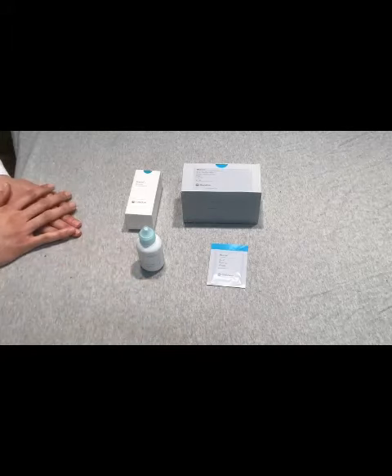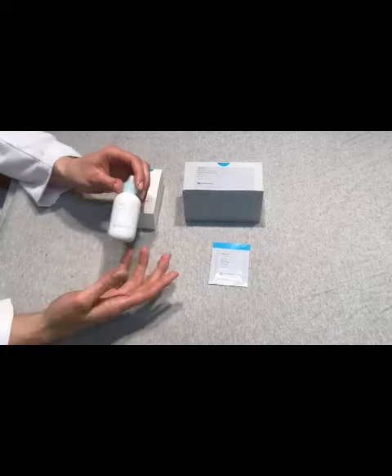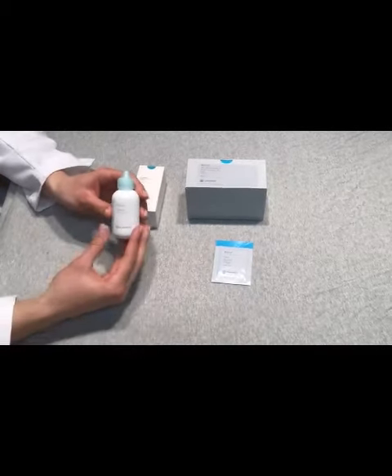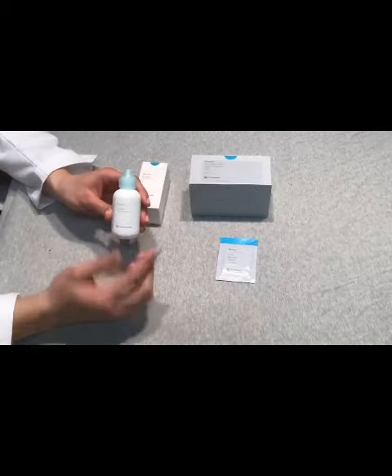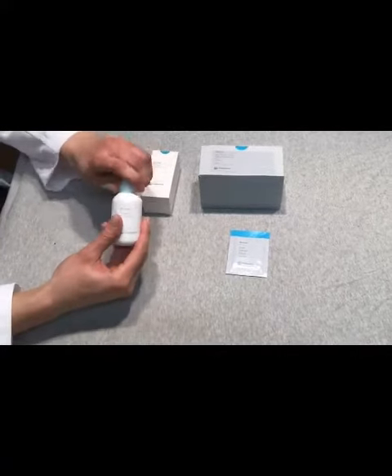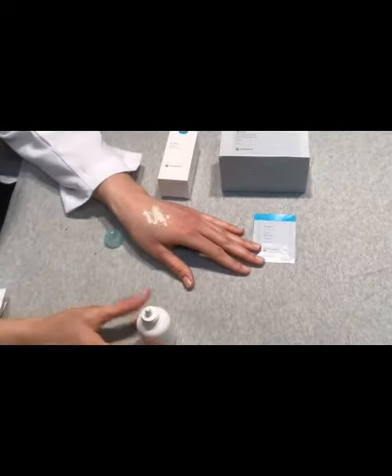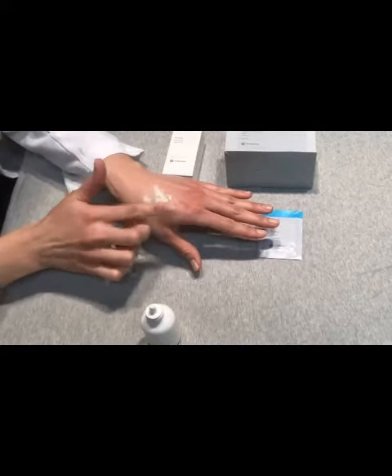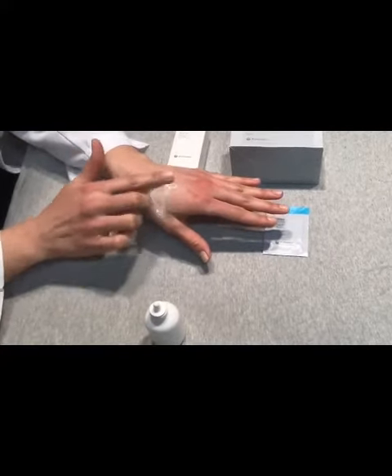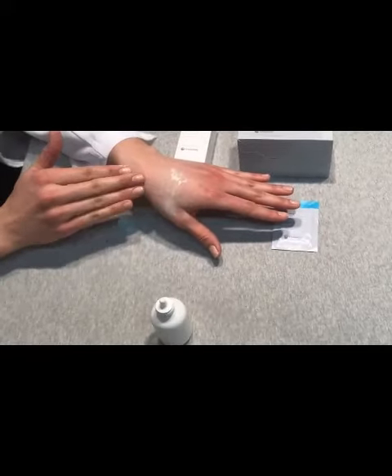I'm going to start with the Brava powder. The powder is used to absorb moisture. For instance, if the patient has irritated skin that's weeping, this particular powder will help absorb some of that moisture. To apply it to the patient's irritated skin, make sure you tap off any excess powder. This leaves a nice thin film of powder over the irritated skin.